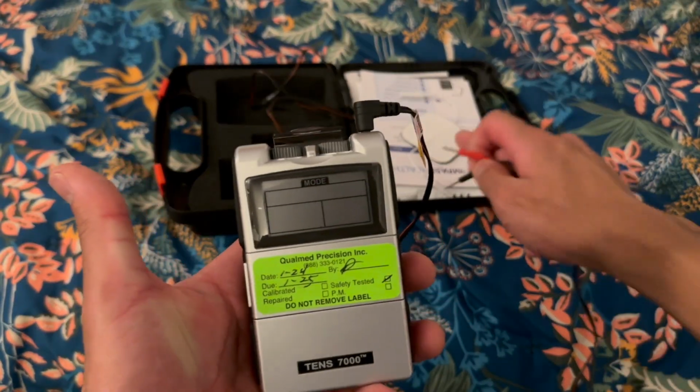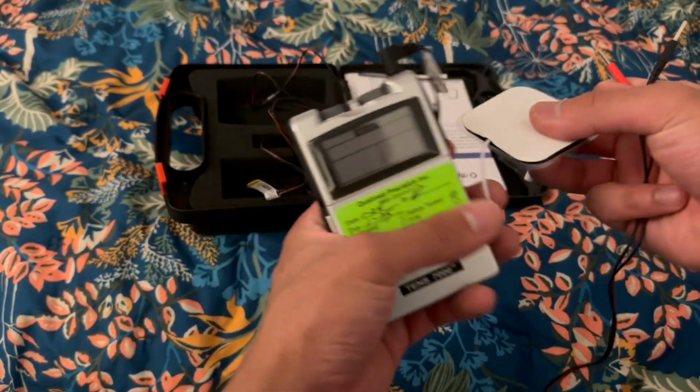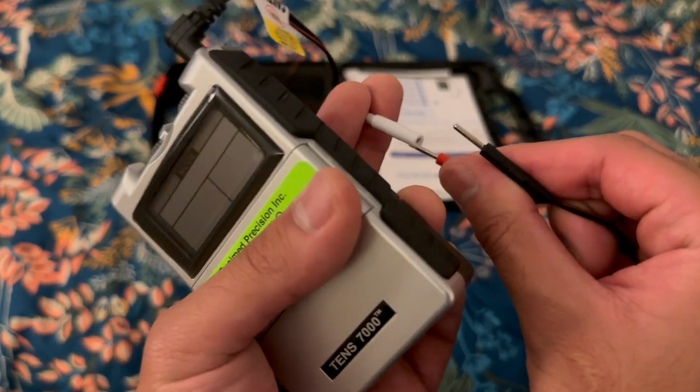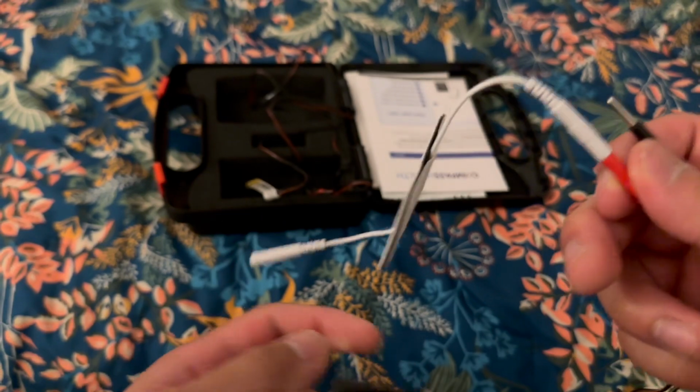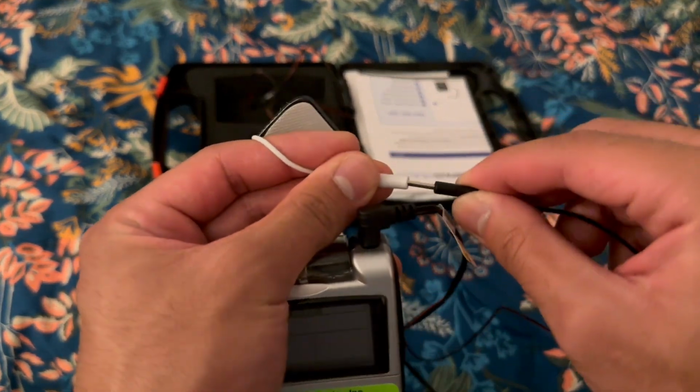So one area can have more intensity than the other and vice versa. To make it easier for electrode pad placement, we can attach these right now rather than waiting for it to go on the skin. So one end of the prong goes into the end, and then the other one goes into the other end. Just like that.